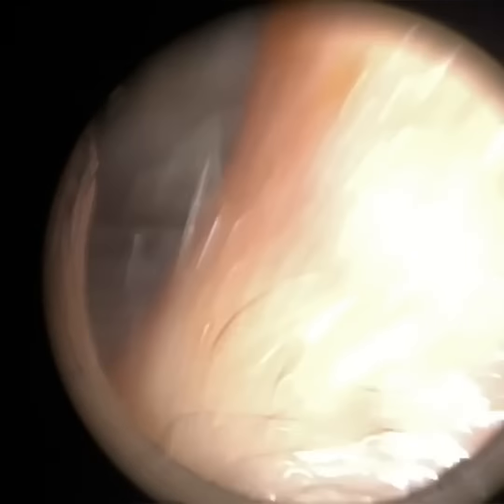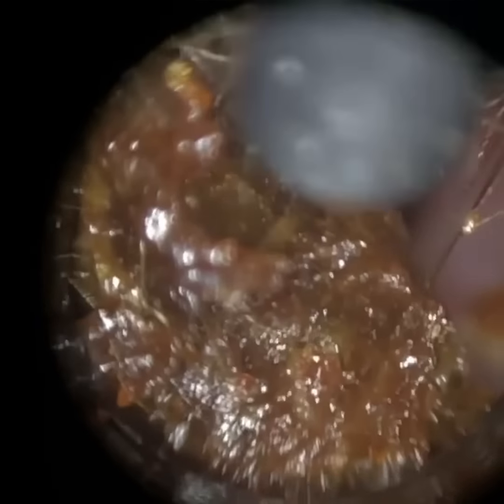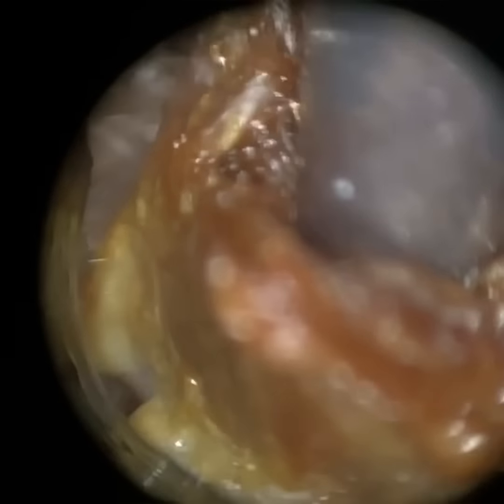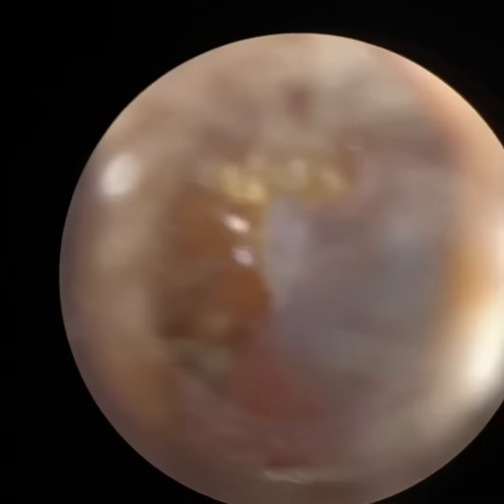So what an ENT operating microscope does, it artificially converges the distance between your two eyes. So it enables you to visualize wax or the eardrum deep in the ear with both eyes. So that gives you binocular depth perception.